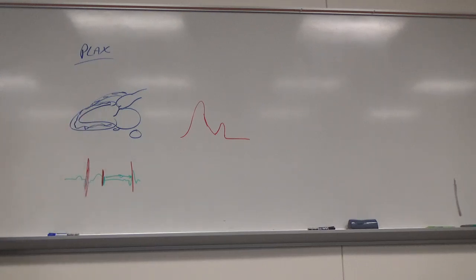So the first ones we're going to measure are the walls. Now the other thing we need to note before we do that is the leading edge to leading edge concept. Okay? So the ultrasound beam is coming down. It first hits my interface here. Okay? And then it hits the next interface here.